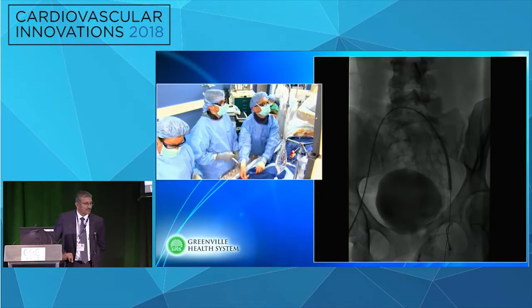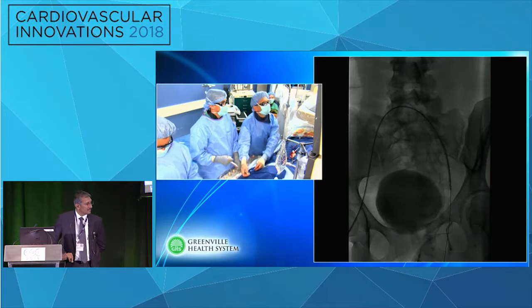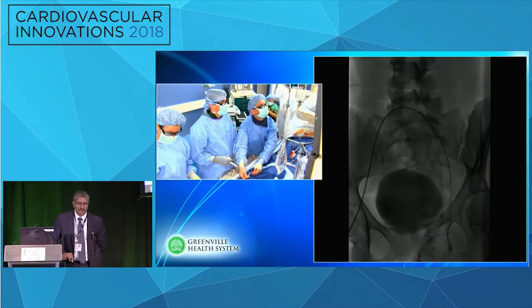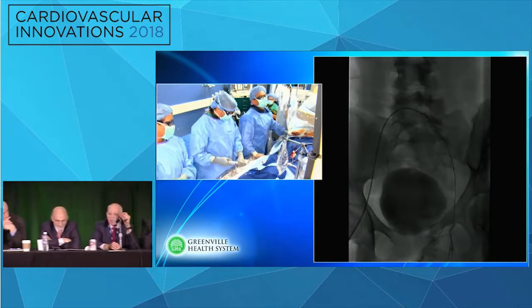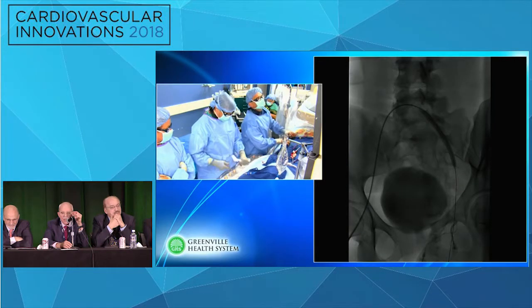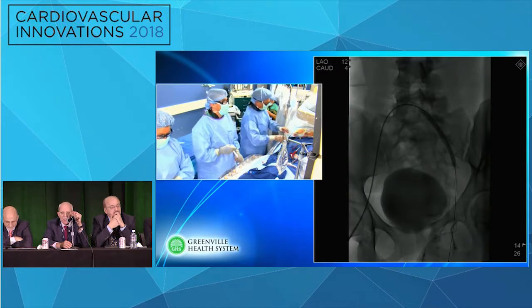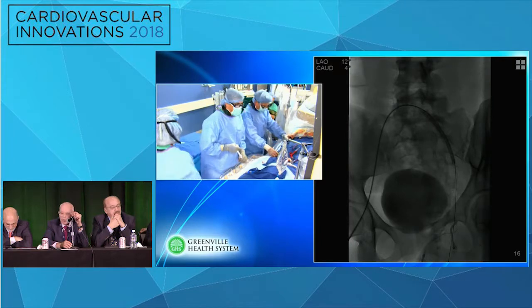So Bruce, as you're going through this, certainly I think it's reasonable to undersize initially, but one of the critical issues, and the things that we as interventionalists have been criticized for, is that often when we stent these May-Thurner type cases, we in fact undersize the stent. So I'm curious what your thoughts are as you go through that algorithm in your own mind as you decide, how should I stent this? How am I going to size this?